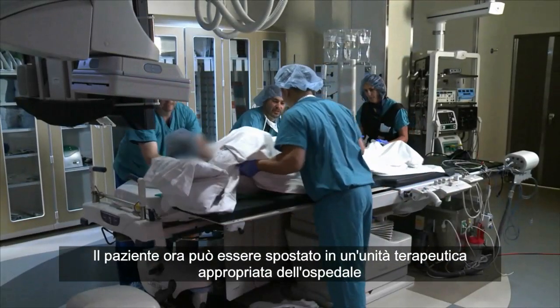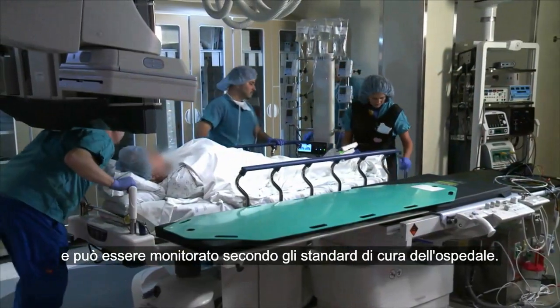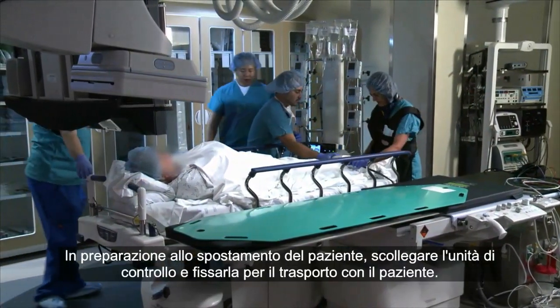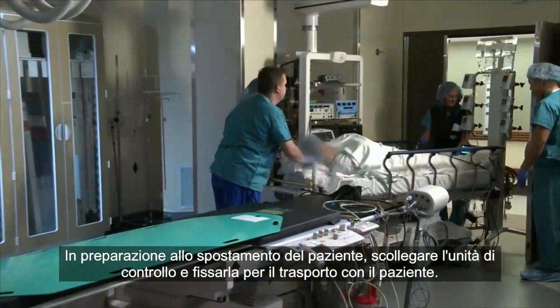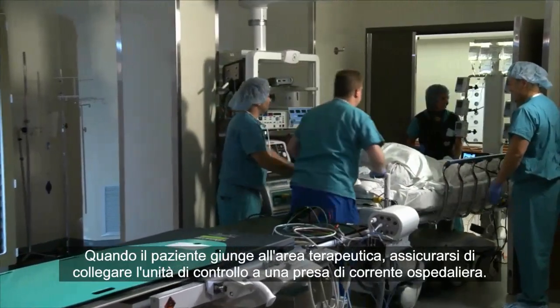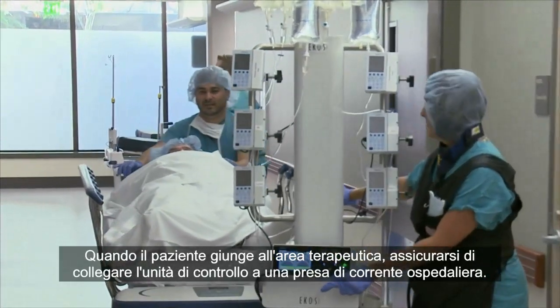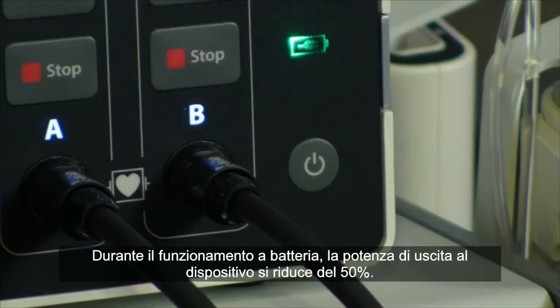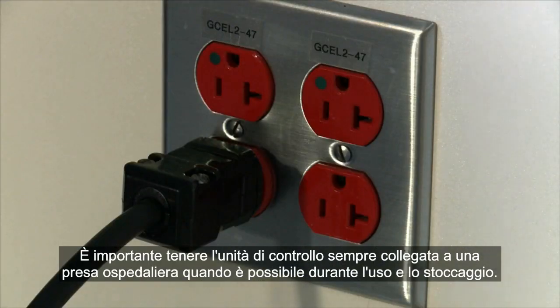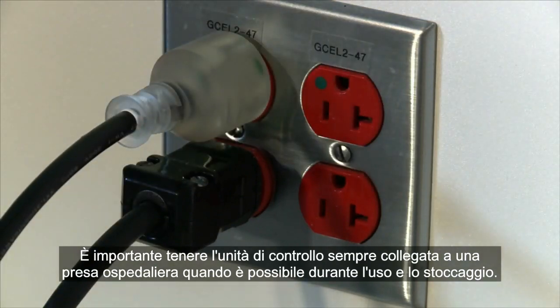The patient may now be moved to an appropriate care unit of the hospital and monitored per hospital standard of care. To prepare for moving the patient, unplug the control unit and secure it for transport with the patient. When the patient reaches the patient care area, be sure to plug the control unit into a hospital-grade outlet. During operation on battery, outlet power to the devices is reduced by 50%. It is important to always keep the control unit plugged into a hospital-grade outlet when possible during use and storage.